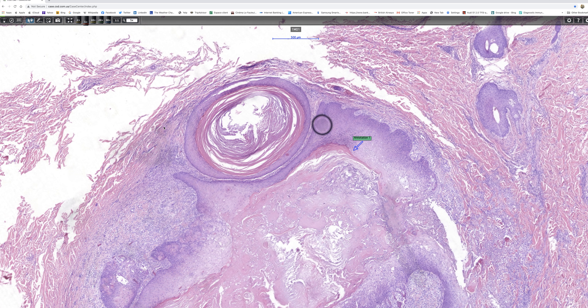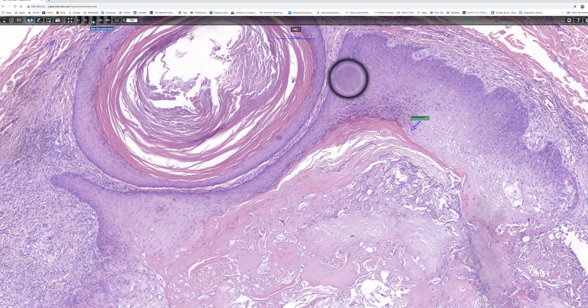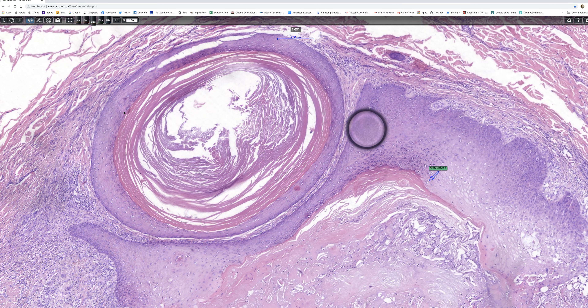I think that's fine for that part of the lesion. So we could regard this bit as typical epidermoid cyst.